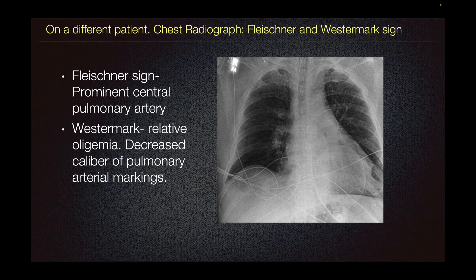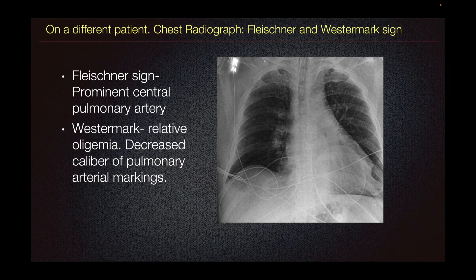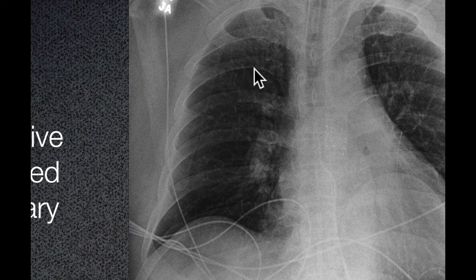Additional radiographic findings described are the Fleischner and Westermark signs, as in this different patient's chest radiograph. Fleischner's sign is a prominent central pulmonary artery, as seen here, but this finding is not specific for PE and could be seen in patients with pulmonary arterial hypertension. Westermark sign is relative oligemia on the periphery, consistent with decreased caliber of the pulmonary arterial markings, with decreased pulmonary arterial markings than expected.